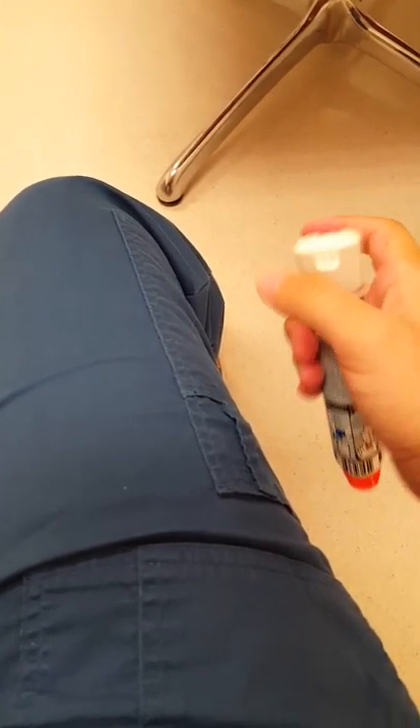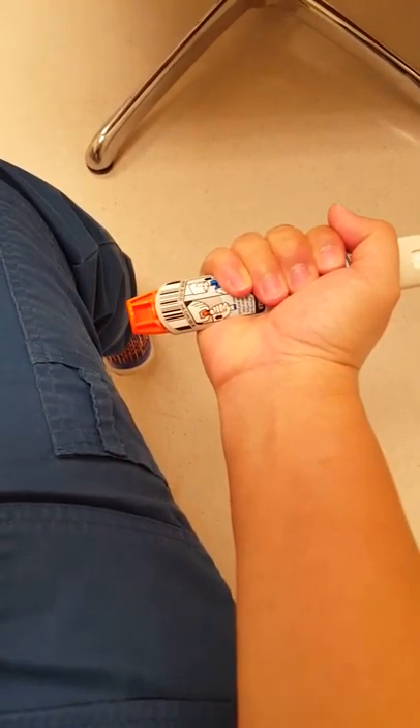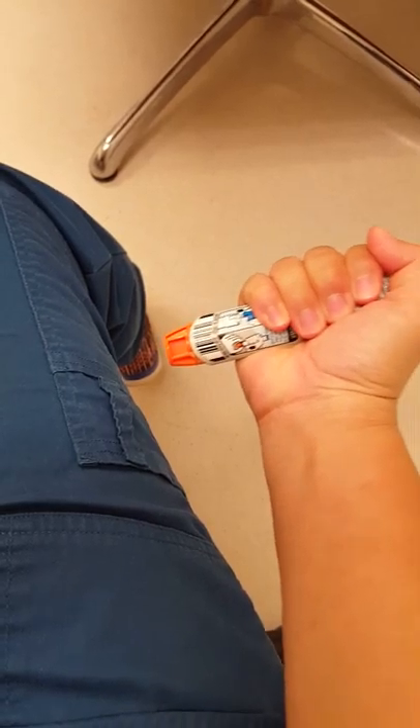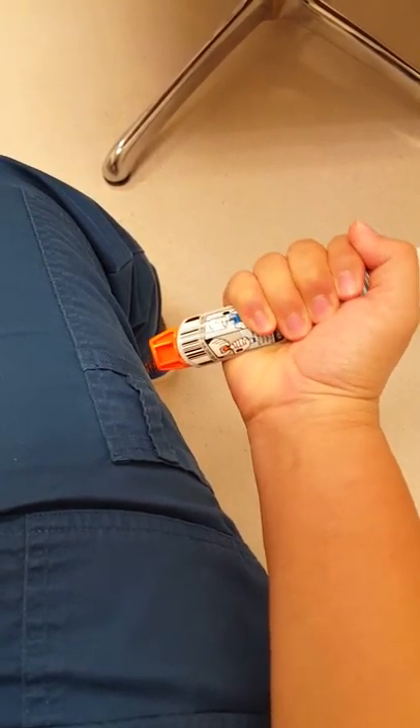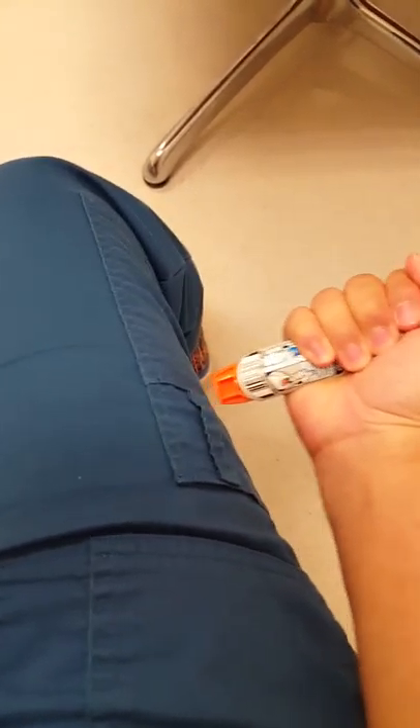So you've taken off the blue cap. You want to hold the EpiPen auto-injector like so. Push down the orange tip — or red tip — where the needle will come out, deep into the side muscle of your thigh, quickly.